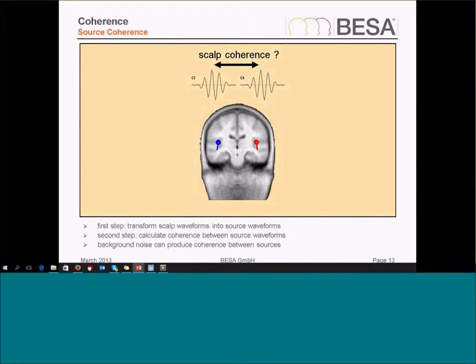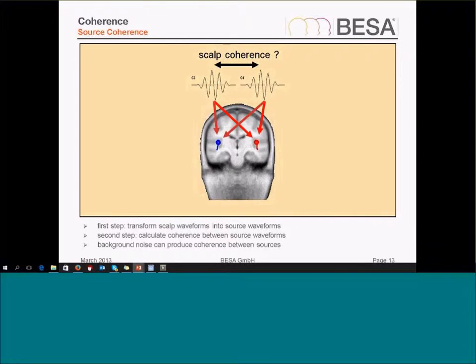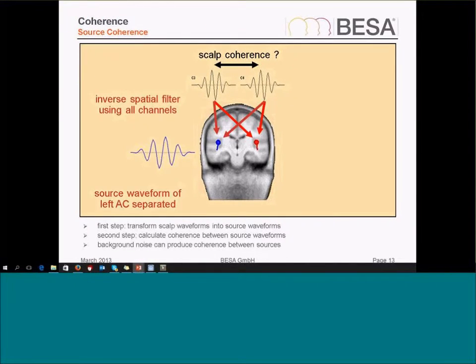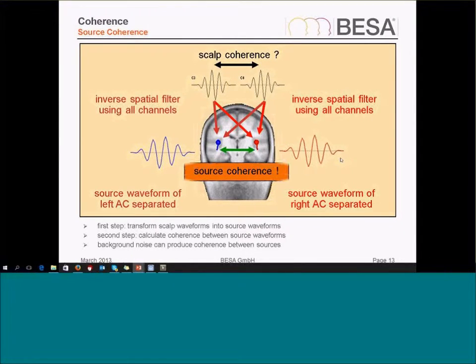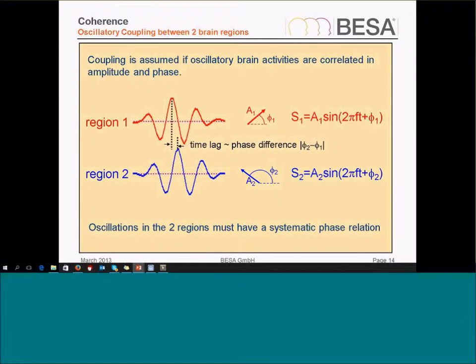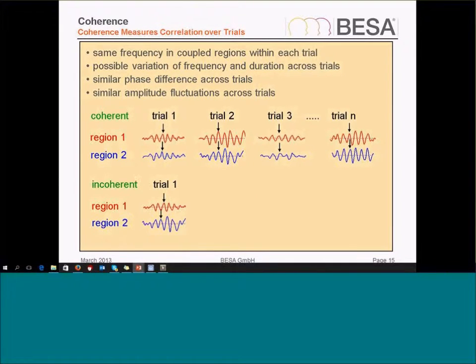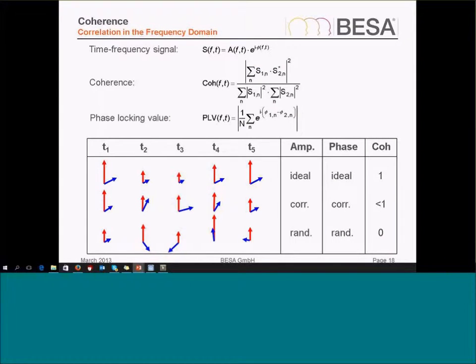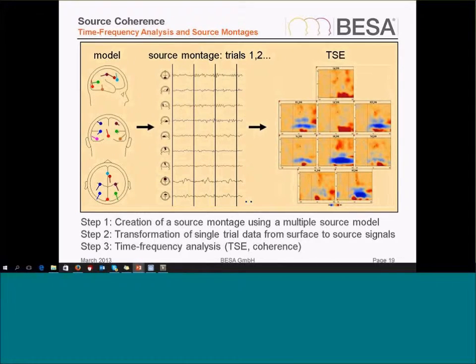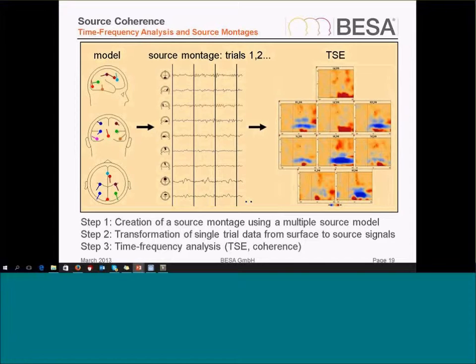Our approach is to first transform this scalp signal into brain source signals using the source montages, and then reconstruct the waveforms and then calculate the coherence between these source channels. I need to skip the explanation of coherence here. Instead I'm going to show you some examples in a minute.